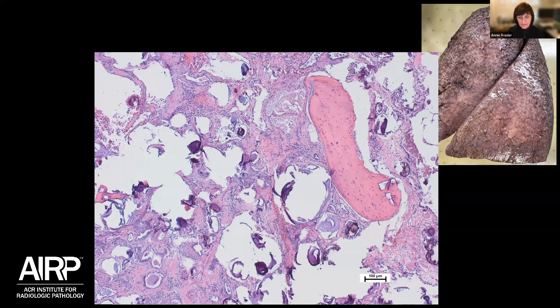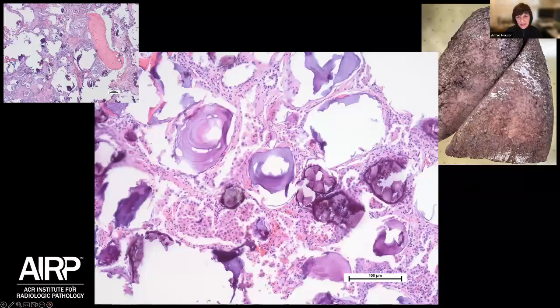And then you see a lot of dots of these little blue cells, which tell us that there is a chronic inflammatory infiltrate in the tissues as well. Now, this beautiful high-powered picture, a blow-up of the upper left corner of the medium power view, shows you that these purplish brownish lesions are a lamellated looking collection.